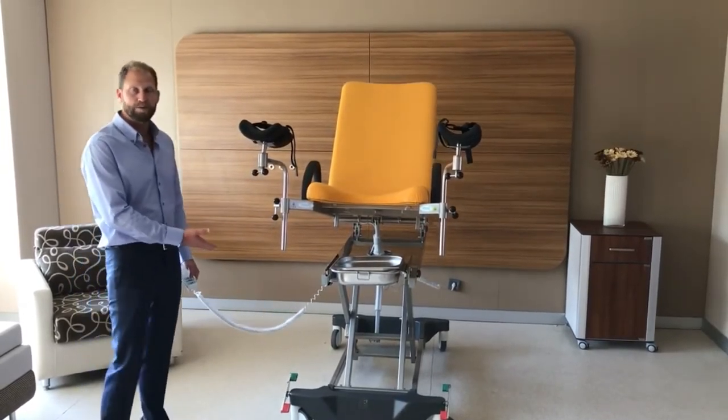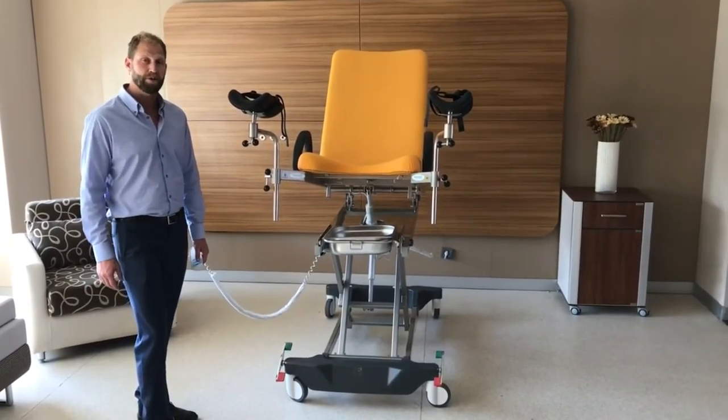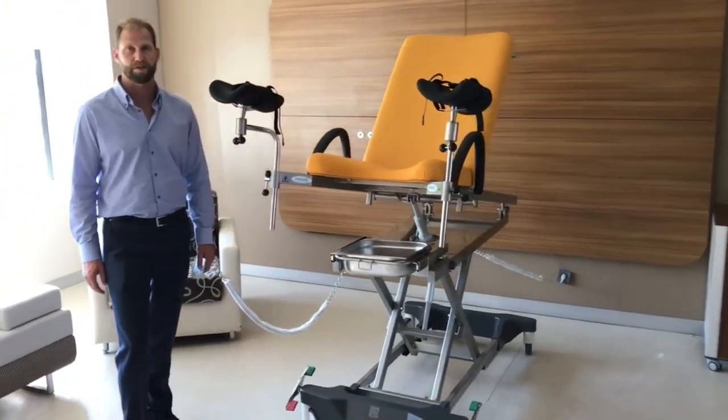Central locking brakes also come with this as standard, so moving it around is not a problem. If you have any other questions, visit our website at www.hntmedical.com or give us a call at 888-733-4272. Thank you.